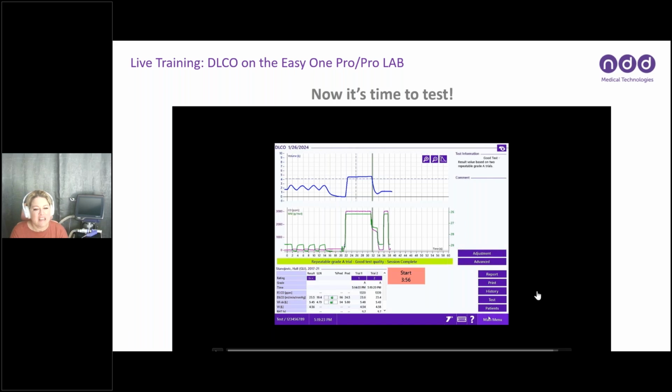All right. A few other things about the DLCO test. Patients really don't complain about anything other than that the gas tastes weird. Sometimes it can dry out their mouth a little bit. So if other testing that day allows them to have a drink of water maybe between trials, that can help. If the patient leaks or if they cough, anything that would cause them to take the mouthpiece out of their mouth, the device will obviously kick the trial out. We really do need it to be pretty consistent.